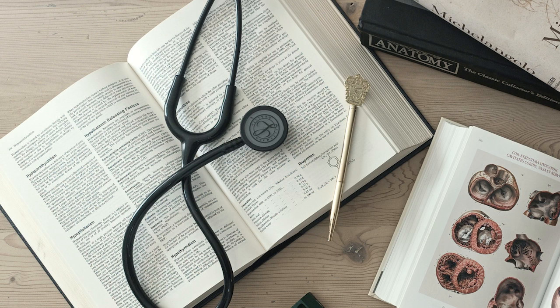What's the clinical significance of this for the patient and how do we manage it? Clinically, first-degree heart block is usually asymptomatic and is often an incidental finding discovered during a routine ECG. It's rarely the cause of a patient's symptoms. When you assess the pulse, it might be slightly slower than normal, but it will be entirely regular. Okay, usually no big deal clinically. Generally not on its own.